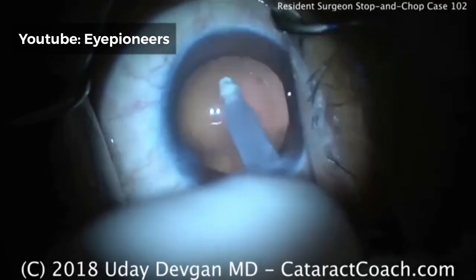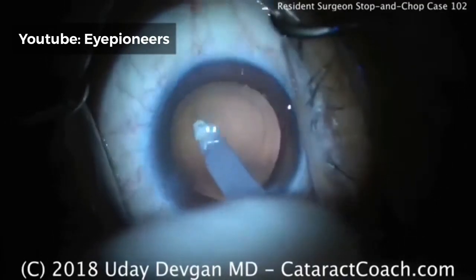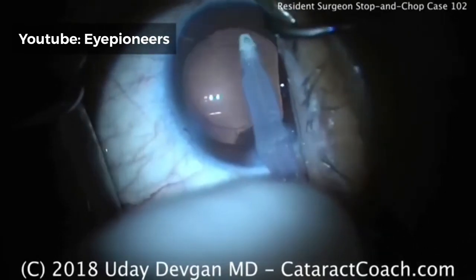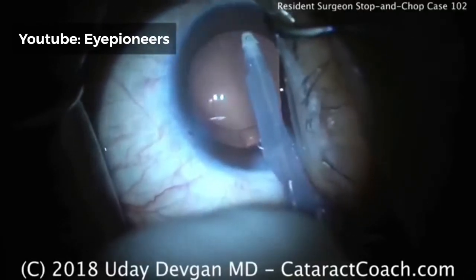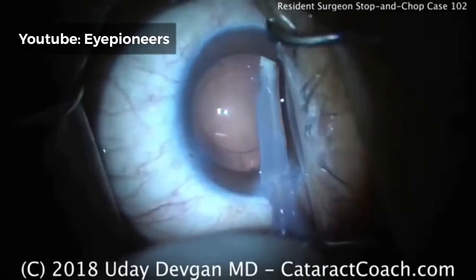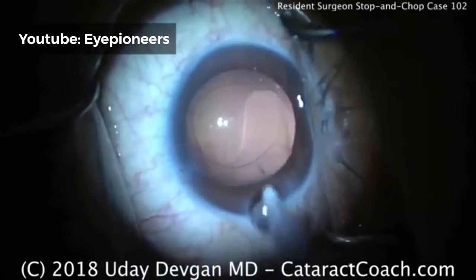It's not a big deal to have to do a YAG laser capsulotomy later — that's an easy procedure. If it were my own eye having cataract surgery, I just don't want a capsule rupture. I'll tolerate a little opacity of the posterior capsule, because after a month or two of healing we can certainly do a YAG laser capsulotomy and clear that right up with very low risk.